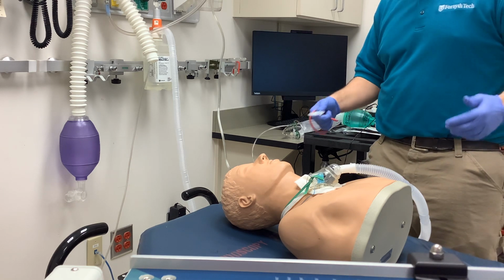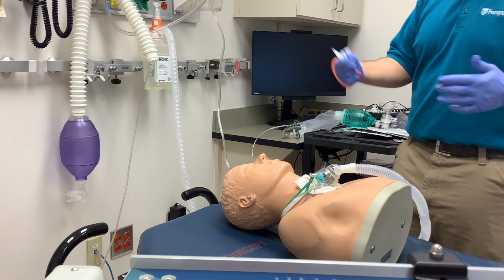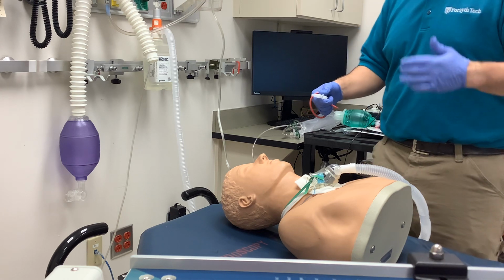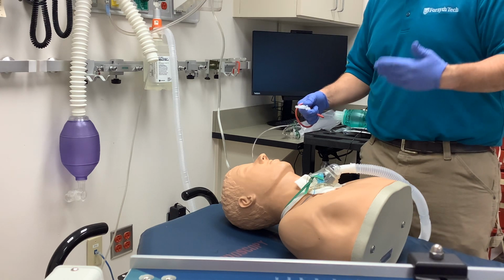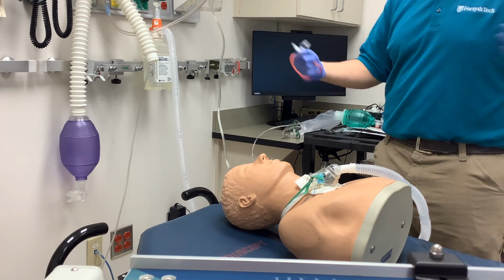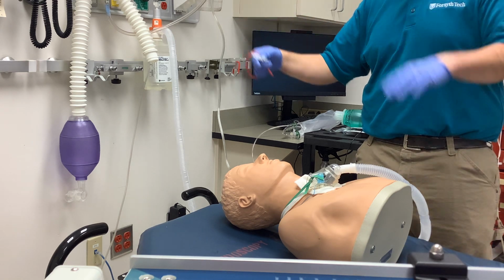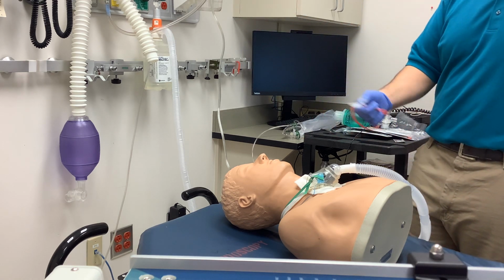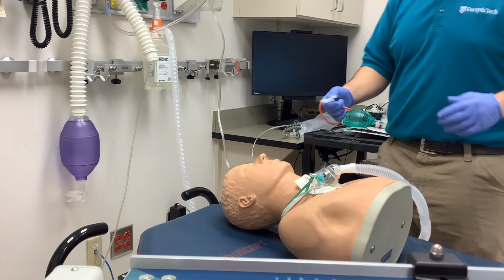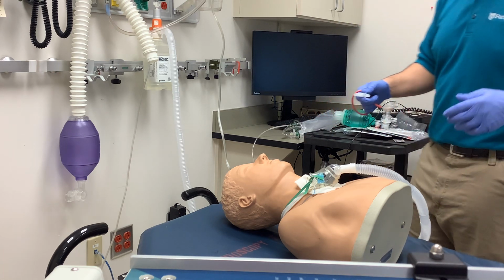A lot of people would document that that's the FiO2, and not to get too hardcore into stuff, but in order for the FiO2 to truly be 35%, you would have to make sure that your total flow output, remember your air to oxygen entrainment ratios, your total output flow would need to meet or exceed this patient's peak inspiratory flow demand in order to truly be 35%. So that being said, you may want to hyperoxygenate your patient.